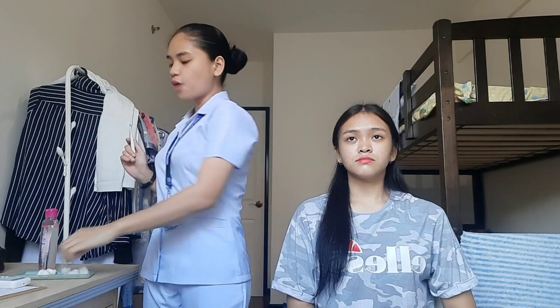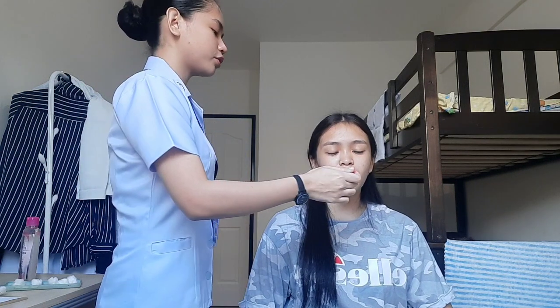Next, I will rinse the thermometer by using an alcohol swab, with a firm twisting motion from the bulb to the stem. This twisting helps to come in contact with the thermometer's entire surface. So, ma'am, please open your mouth. I will leave the thermometer in place until a signal or beep is heard.